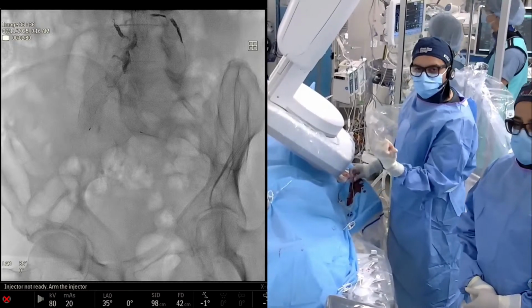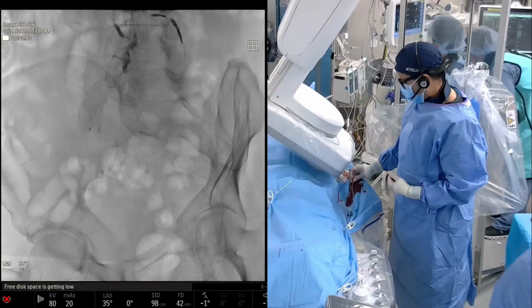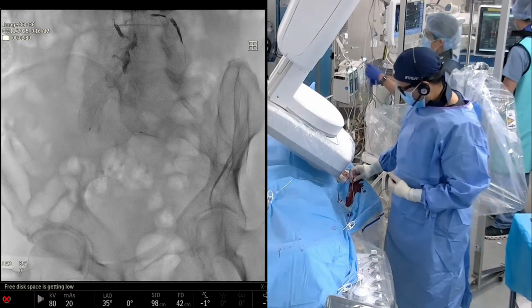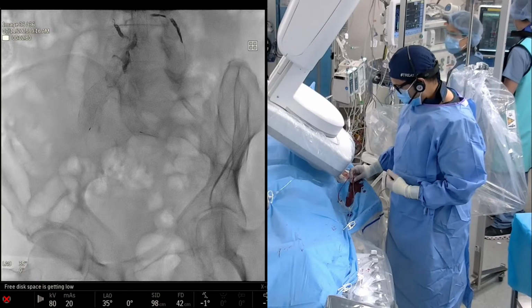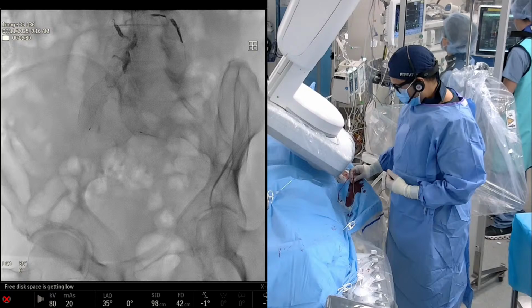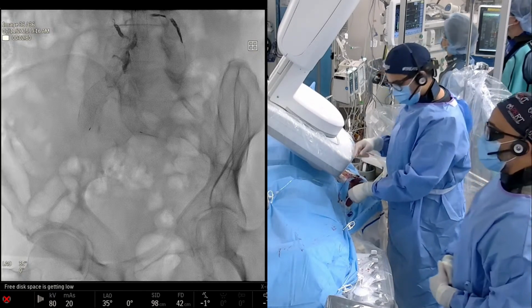And obviously, we're in the limb. So yeah, we used to do that with patients with big open IMAs. There's some data to show that it decreases the rates of type 2 endoleaks. Although again, this guy still ended up with a different type 2 endoleak and a type 1B. It's not so bad, though. It's like a 12-year-old graft, right? So he's really only had 2 interventions.